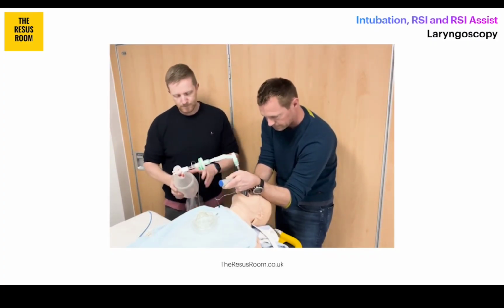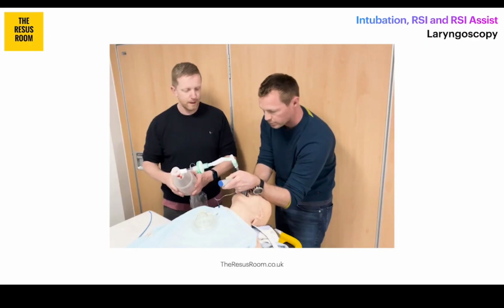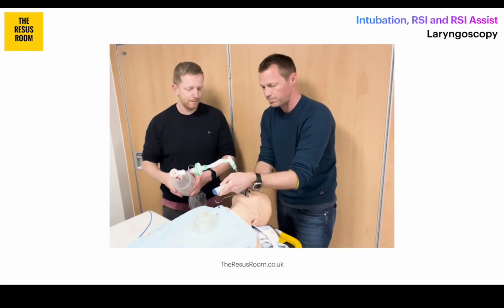On goes the circuit: catheter mount, filter, end tidal, bag valve mask, ventilations. You can see immediately that the tube is misting. You can see that the chest is rising and falling. We're going to have an auscultation again in a minute, and we've seen the end tidal is there. We've confirmed the tube placement. Happy with the depth at the teeth. And then we're going to secure it into place.